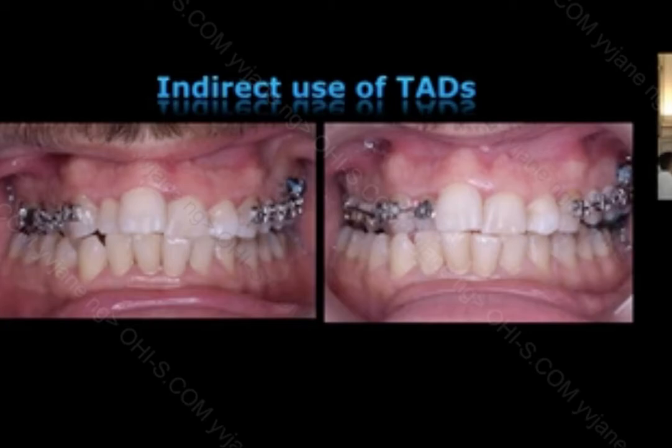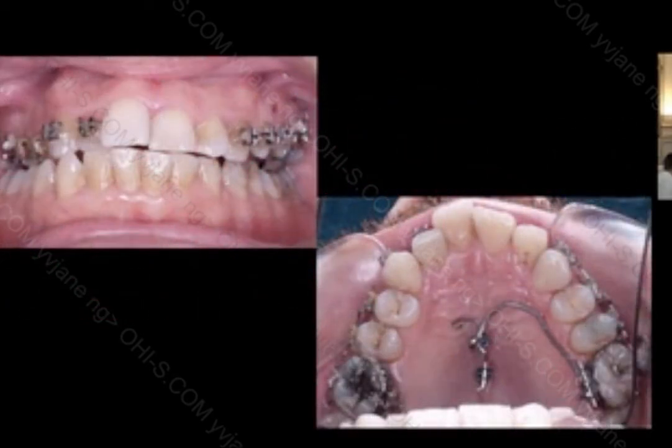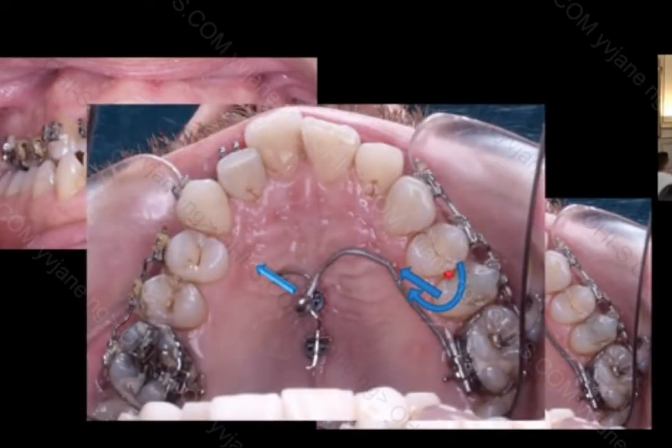But nowadays, as I said, this is something which can be disturbing. You're not happy that this happened. But of course, we have the possibilities to correct this. Since we didn't have enough bone support on the buccal side, I placed a couple of TADs here. And using this arch, which is beta titanium, this was activated in this way.